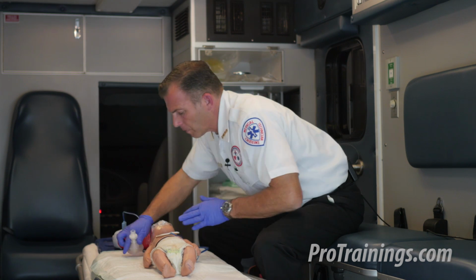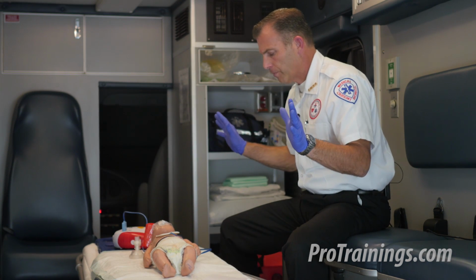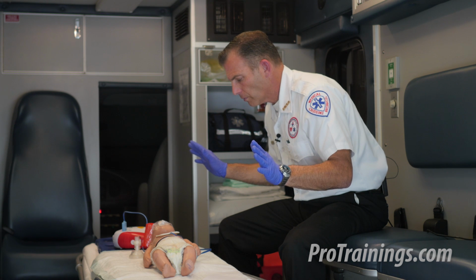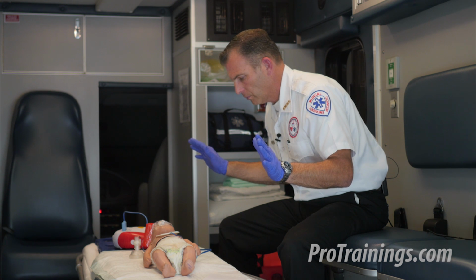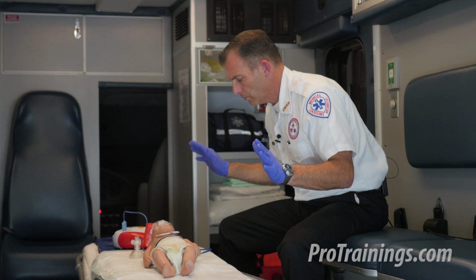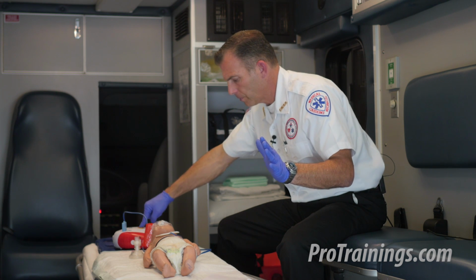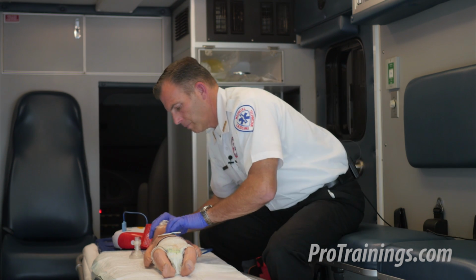Analyzing rhythm. Everyone stand clear. Clear. Shock advised. Charging. Everyone stand clear. Everyone stand clear. Clear. Push the shock button. Shock delivered. Begin 5 cycles of CPR.